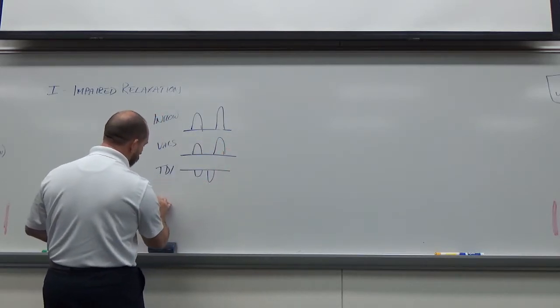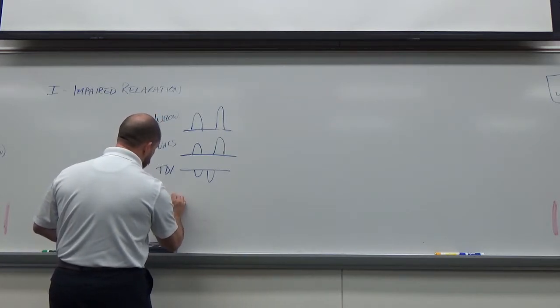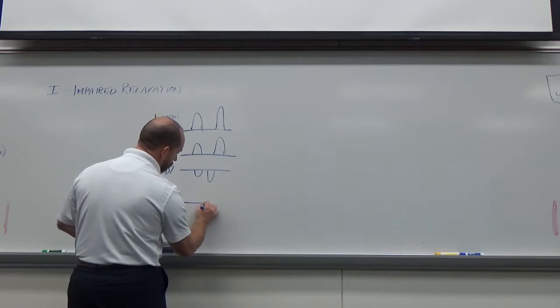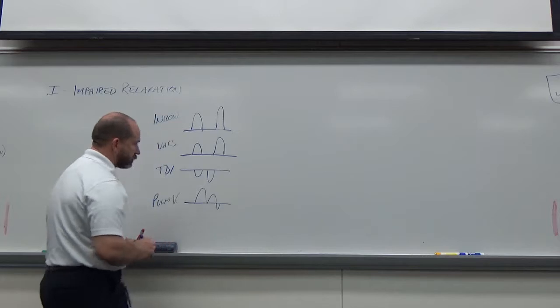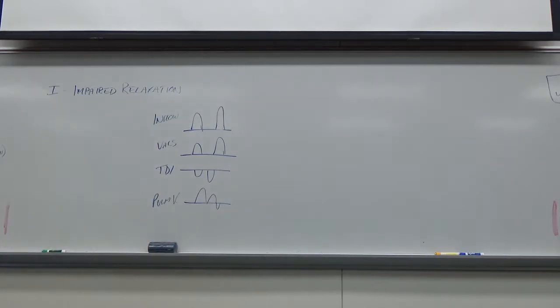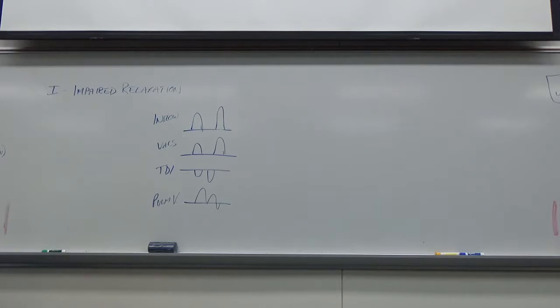That's right. And then pulmonary vein, bigger S, smaller D, there. And I'm not going to draw propagation velocity. They're going to look similar. You're just really looking at what the slope is on those. So, quick format, that's essentially a diagnostic for that. So, again, take the 50-50 visual right off. I'm going to be doing it all as a column of information, multiple pieces of information that should tell you roughly the same story.